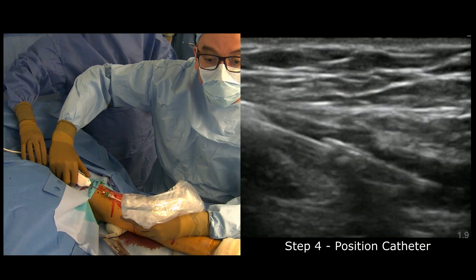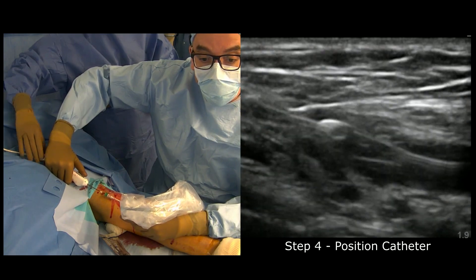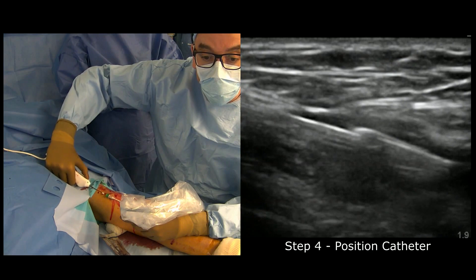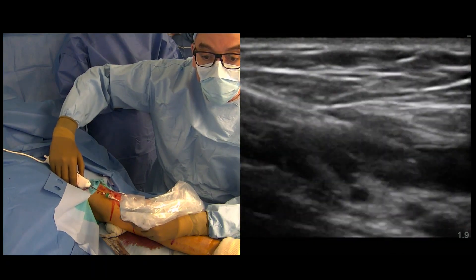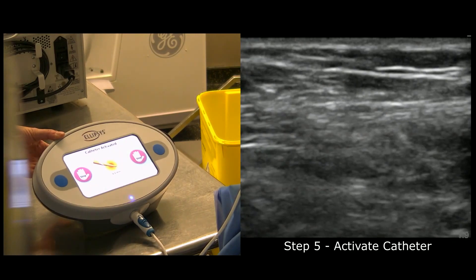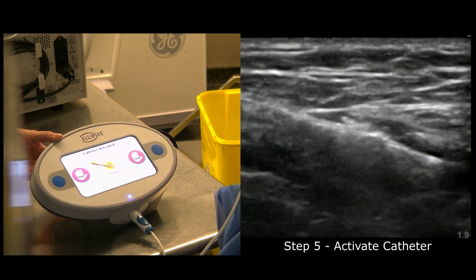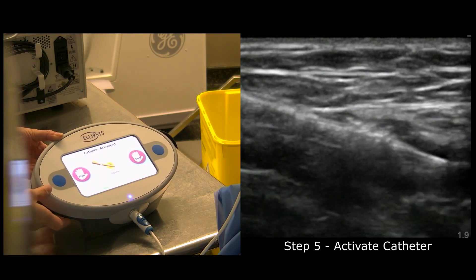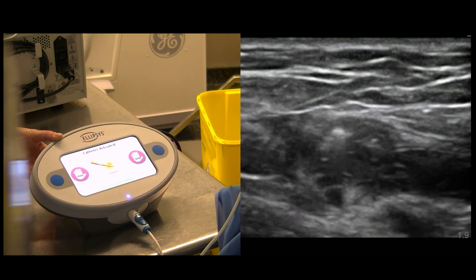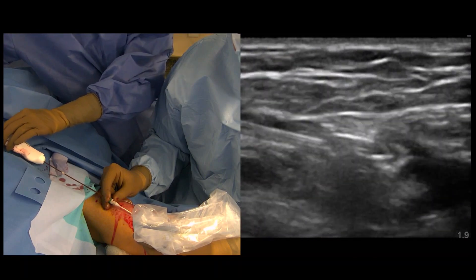We're going to pull the device back, and at some point we'll meet resistance — that's when the device is grabbing the anterior, superior part of the artery. You can appreciate that I'm pulling on the artery at this level. I'm going to close the device and ask my nurse to activate. You can see the device performing tissue fusion, creating the anastomosis. After the first cycle reaches zero distance, I apply very light tension, take the camera out, and you can appreciate the elliptical shape of the anastomosis already created.